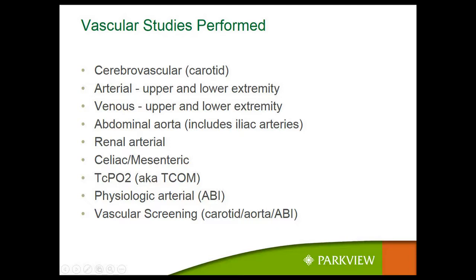TCPO2, also called a TCOM, those we do outpatient, and the radiology staff does the inpatient. They frequently do them for amputation, so that the orthopedic doctors know the level of amputation. And we do it most frequently for peripheral arterial disease and to evaluate the healing of a limb.